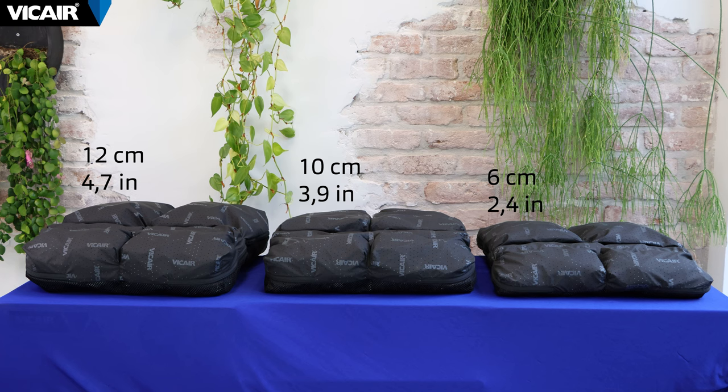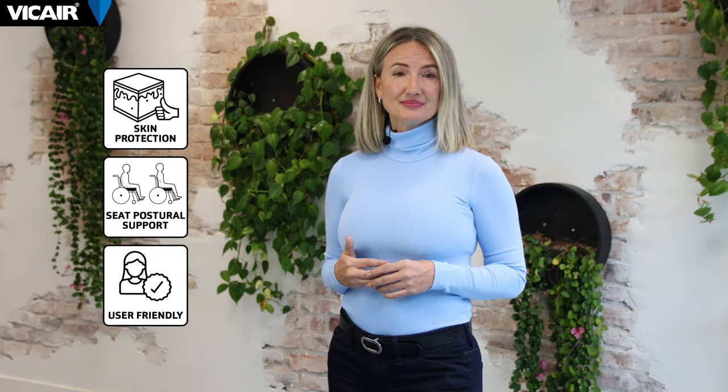The cushion is available in a low model and two high models, and in a wide variety of sizes. The Adjuster O2 offers high performance skin protection, provides optimal postural support, and is user-friendly — in short, the perfect package.